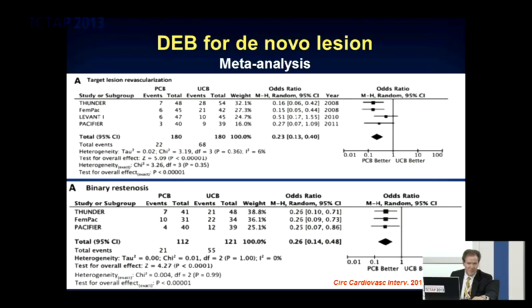So let's turn over to the discussion about the drug-eluting balloons. I don't know about you, John, but when I think about an infrapopliteal lesion, the work we do on an everyday basis, whether we use standard balloon angioplasty below the knee, which I tend to do, we can get a good result, but the restenosis rate is high. Now, that doesn't necessarily imply that the patients do badly. In fact, if you get a good single vessel going down to that ulcer, you'll heal the ulcer and the patient won't have to have the amputation or the amputation is limited.